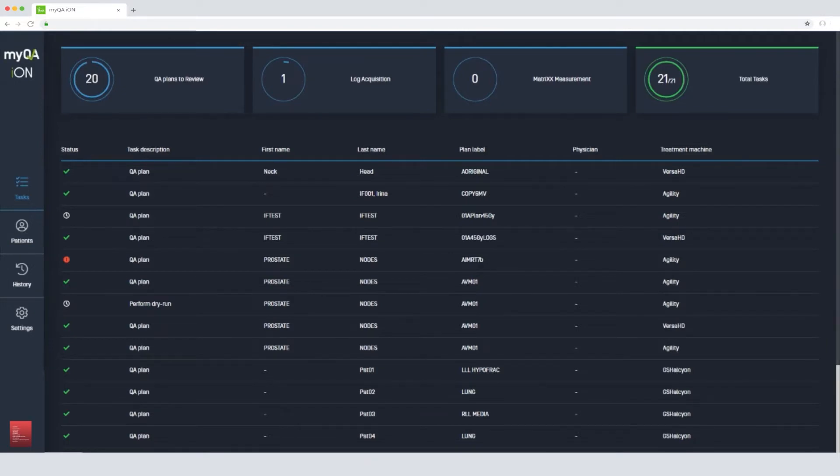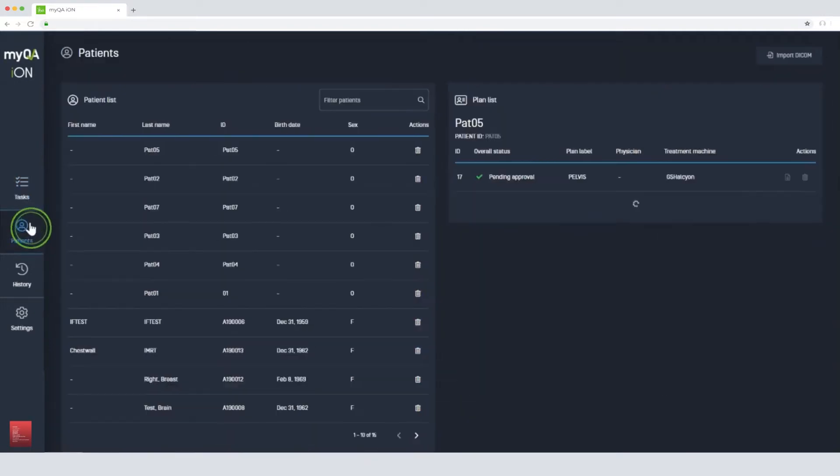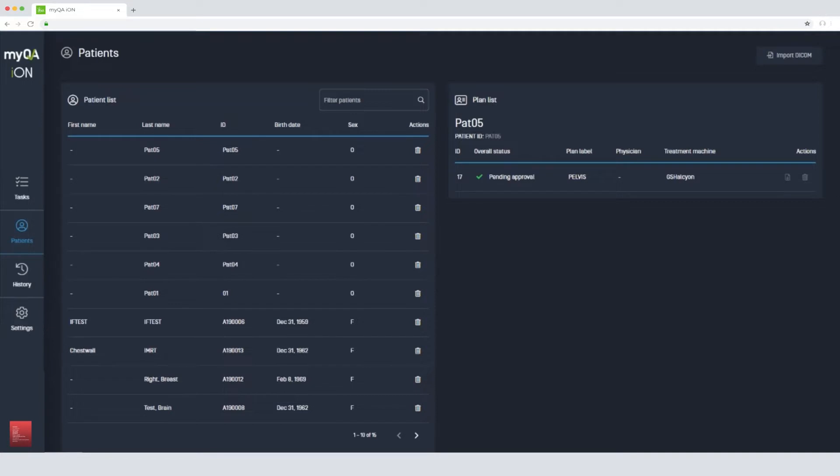When we open the webpage, we can either see a task list or a patient list, depending on your preference. Using these makes your objectives simple and easy to complete and gives you a full overview of all the tasks in real-time.